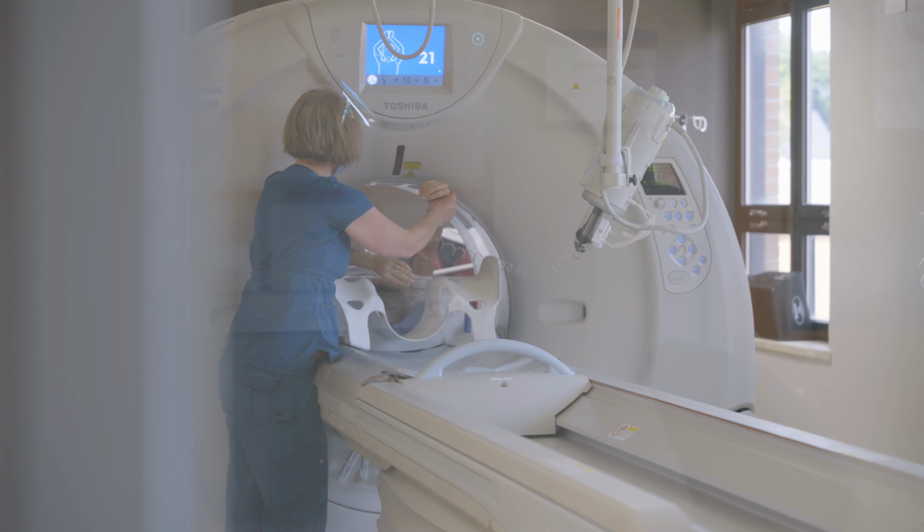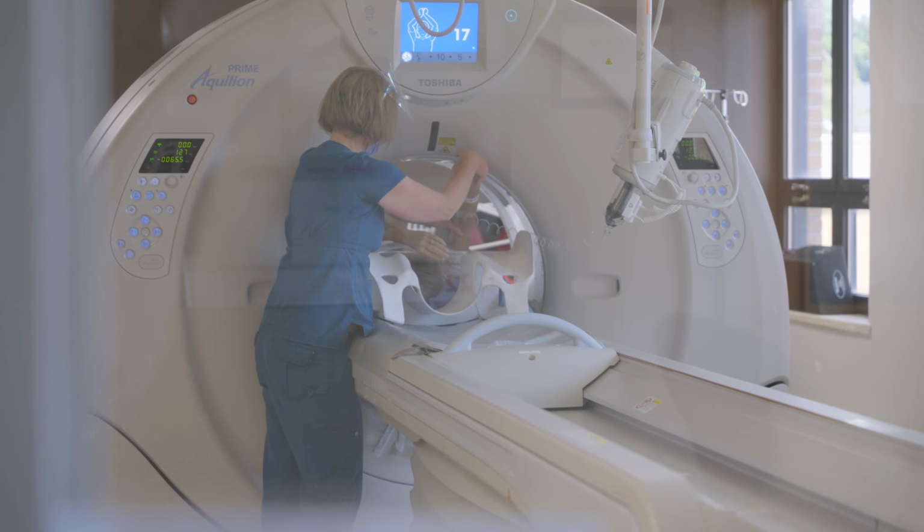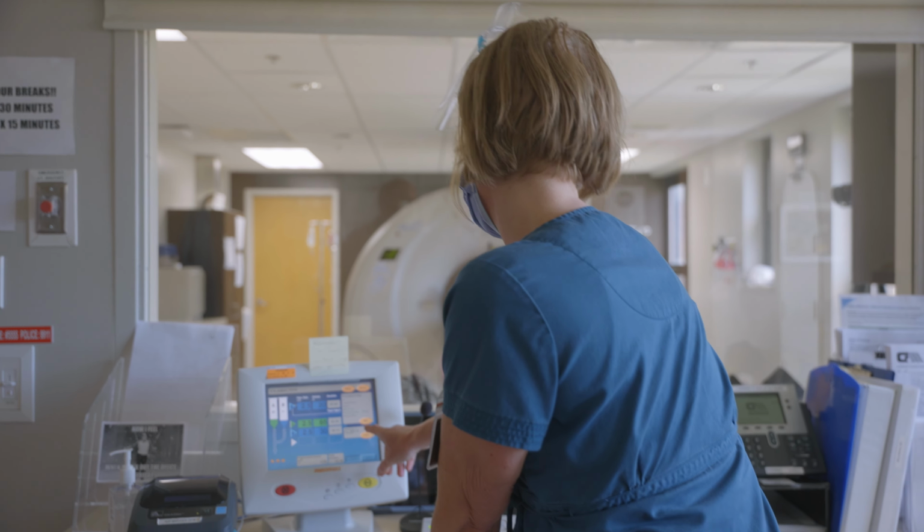As surgeons, CT is very important in helping us plan our surgeries as well as making correct diagnoses. The CT scanner helps us in diagnosing cancers as well as bowel obstructions. For us orthopedic surgeons, we use CT scanners to plan out our surgeries when we're dealing with shattered knees, elbows, and shoulders.